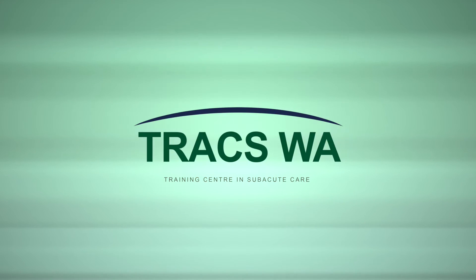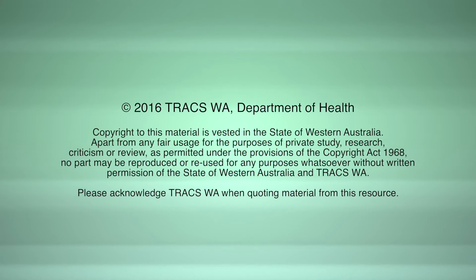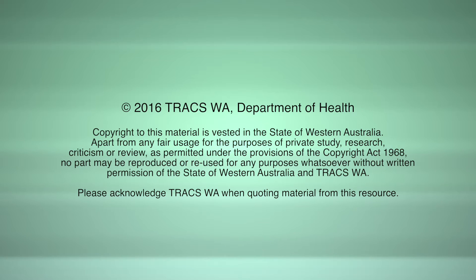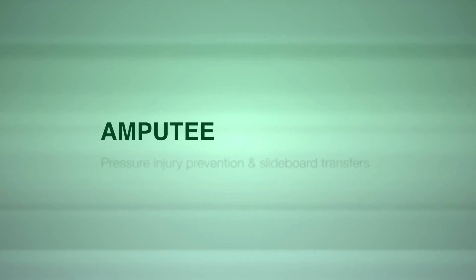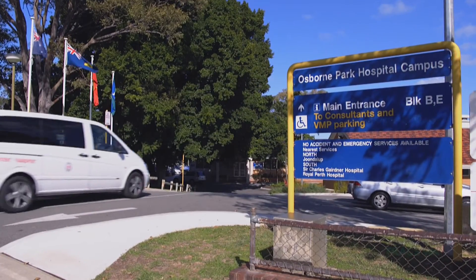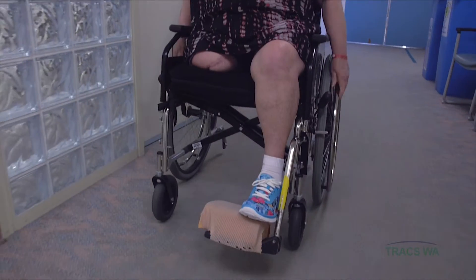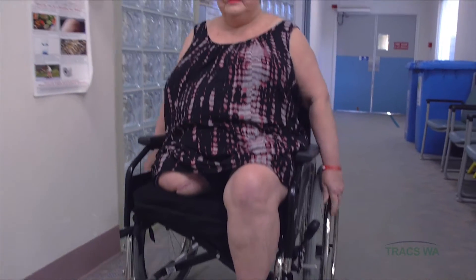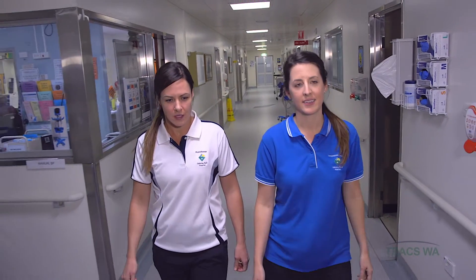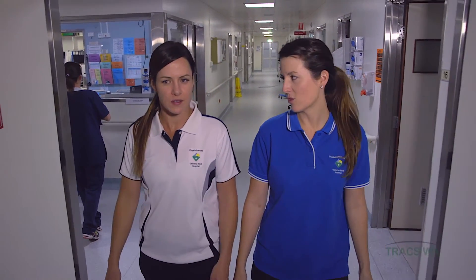This video is presented by Trax WA Training Centre and Subacute Care. In this scenario, 63-year-old Brenda, a recent above-knee amputee, is at Osborne Park Hospital to see Physiotherapist Danielle Jackson and Occupational Therapist Bridget Richards for some general advice and to learn about safe transfer techniques.